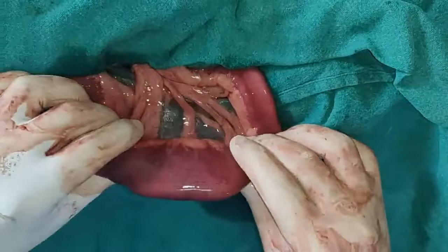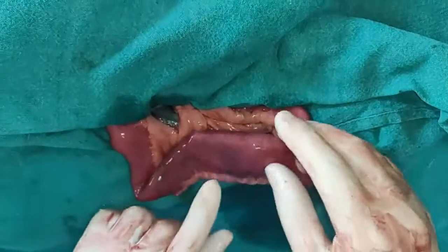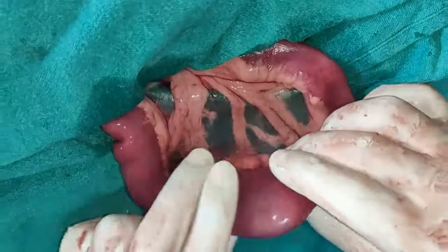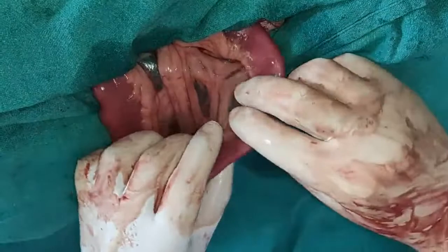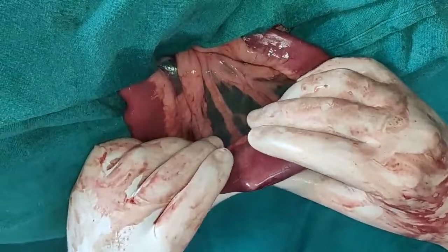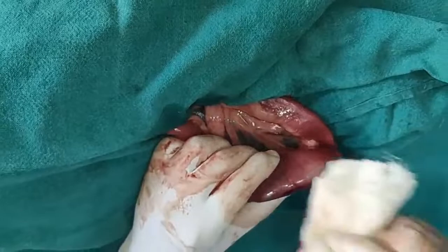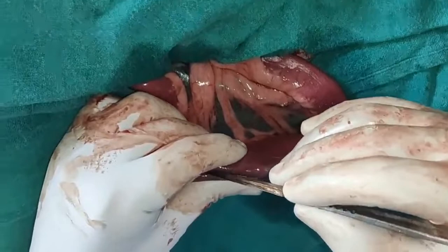So now we try to give the incision away from the obstruction because this is already a bluish area. It is basically almost not healthy. So it is better to make the incision either here or here. Let's see whether it is going here. So it's better to make the incision here. You can see here it is rupturing automatically. So we give the incision here.